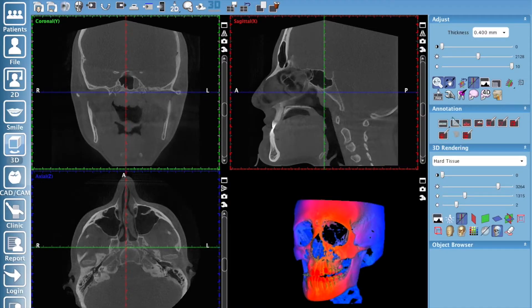Hello, Brent Garvin here with Plan Mecca, here to share with you today how to create a pseudo panoramic from your 3D image. This is typically done on a larger field of view, like a 20x17, but that doesn't mean you can't create a pseudo pan from a smaller field of view like an 8x8 or a 10x10 — just understand that you won't have the condyles in the pseudo pan, and that may or may not be important to you. So let's get started.